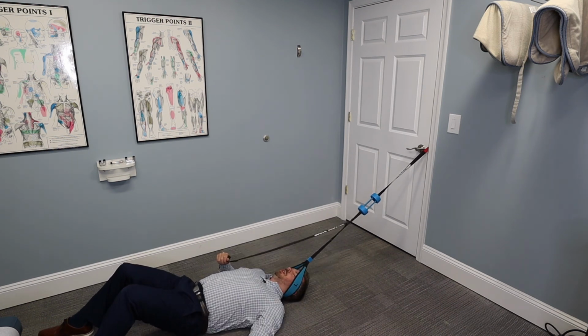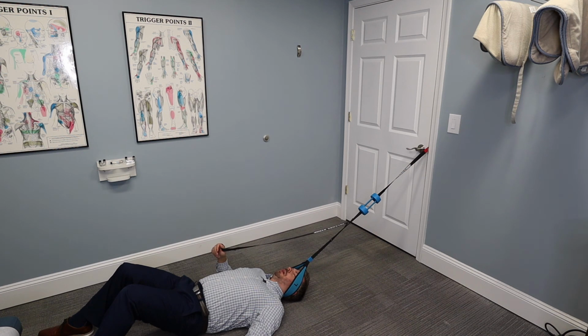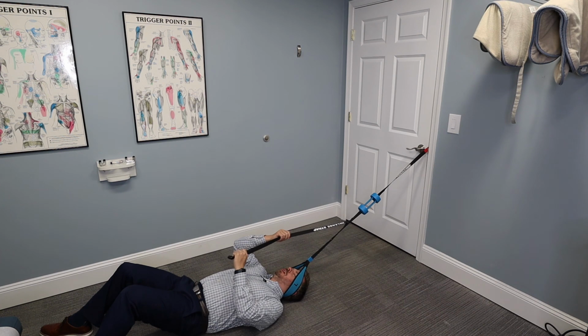Okay, so now we have the unit secured in place. And so it's right on the base of my occiput, right between my upper neck and my occiput. So what it's going to do is gently pull and stretch the neck and take the pressure off the nerves in the neck and upper back. So if you deal with any numbness or tingling that's shooting down your arms, this is going to be a great home unit for you.